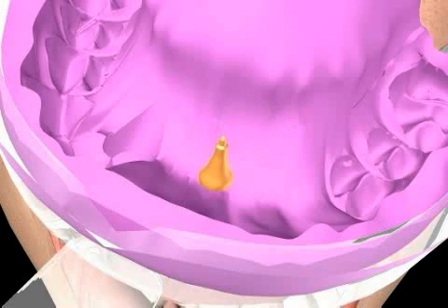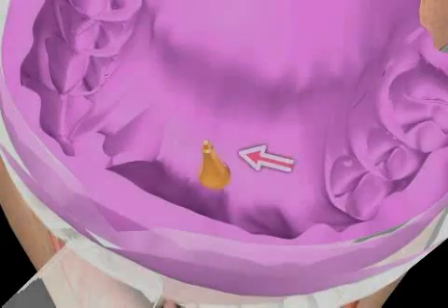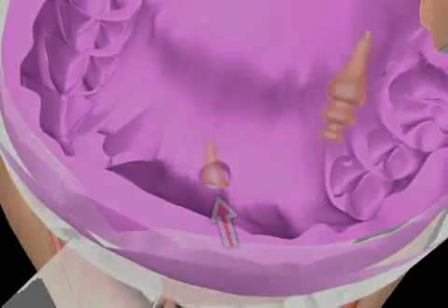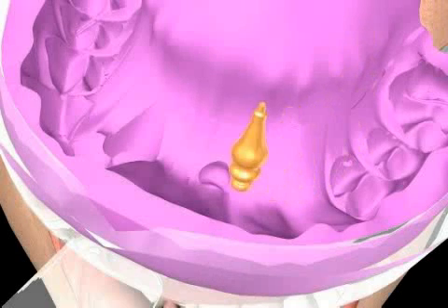Subsequent work on the impression can cause the impression to become deformed. Although the dentist has less work to do with the reposition technique, this method of making impressions is more prone to mistakes.